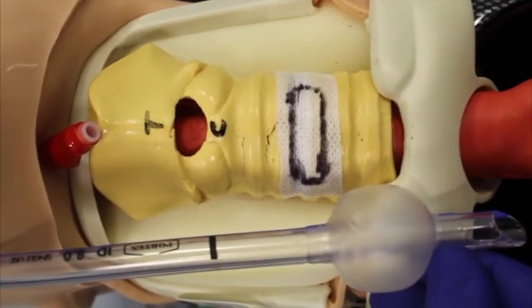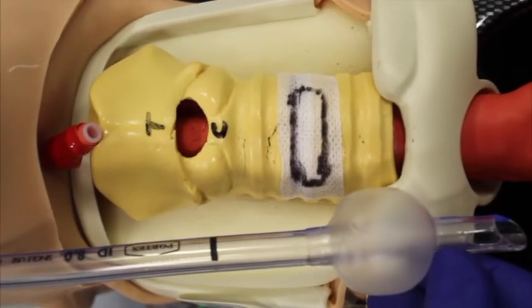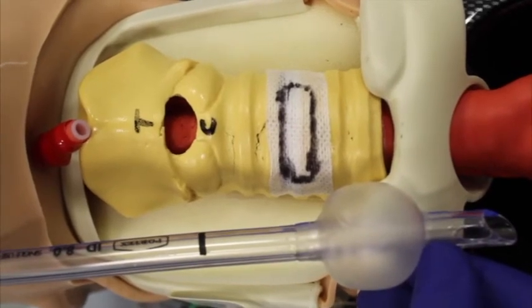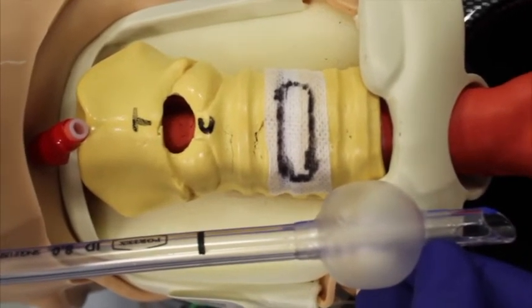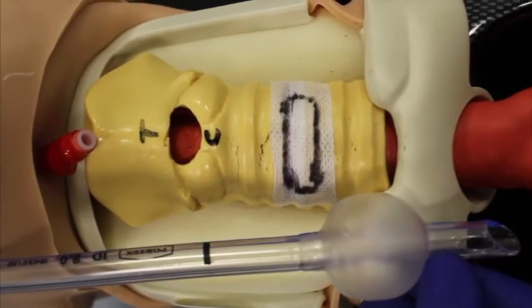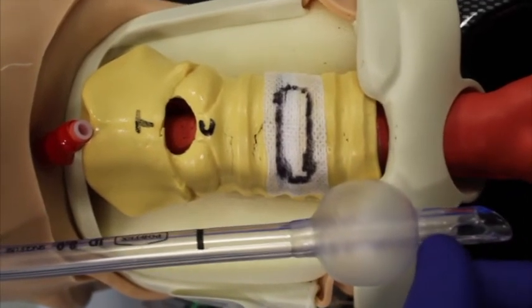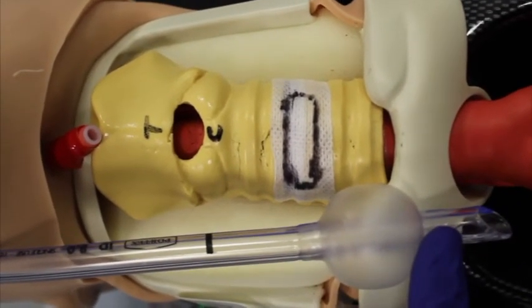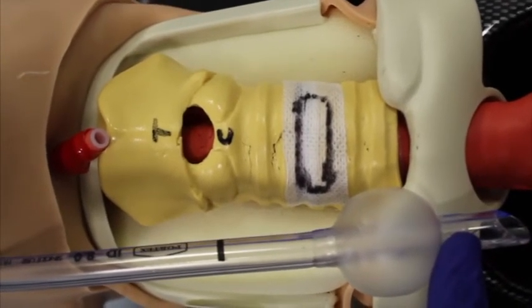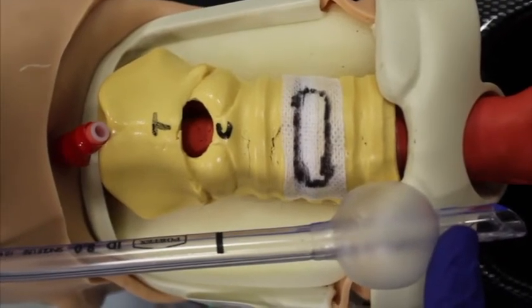Once the balloon is felt to be in the area of the trachea distal to the intended site of perforation, here marked with a black ring, the low frequency, low pressure ventilation may be maintained, and the surgeon may make a proximal horizontal incision above, in this case, the third cartilage ring to perforate the trachea.